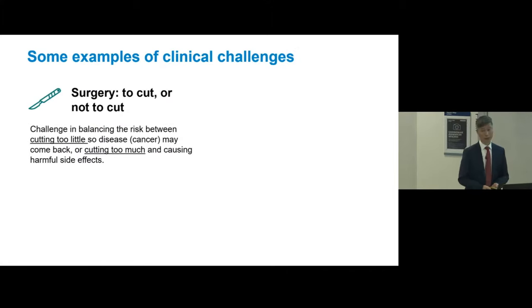So I want to show you a few specific clinical challenges that we're interested in. One is in surgery. The surgeon often faces the choice of to cut or not to cut. It's really a balance: if you cut too little, then the disease, for example cancer, could come back, right? But if you cut too much, you might do extra harm to the patient and cause serious side effects. So that's a significant challenge.